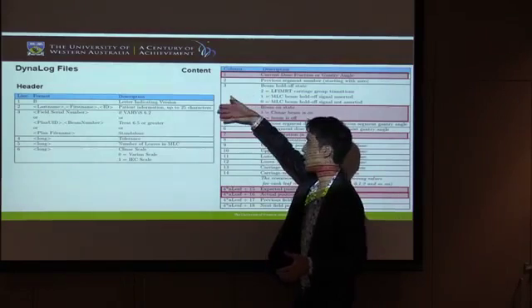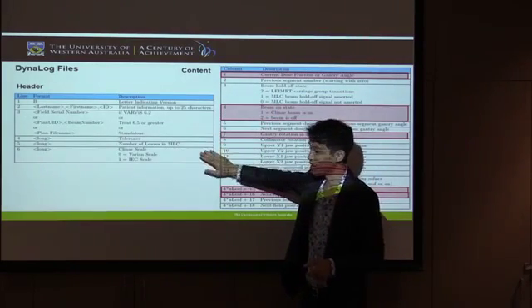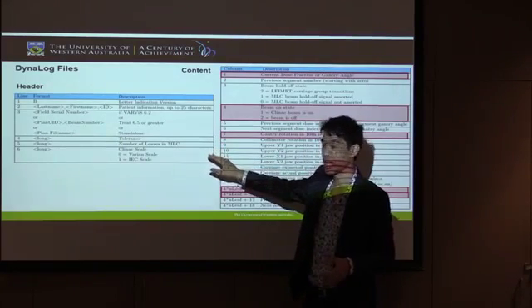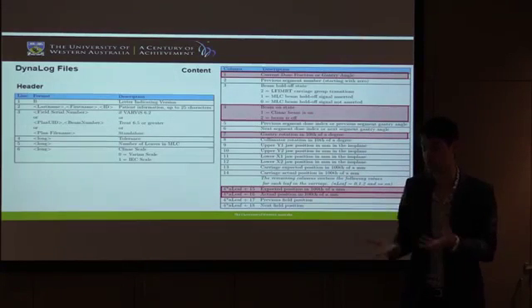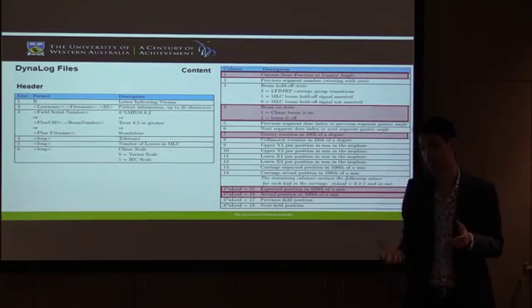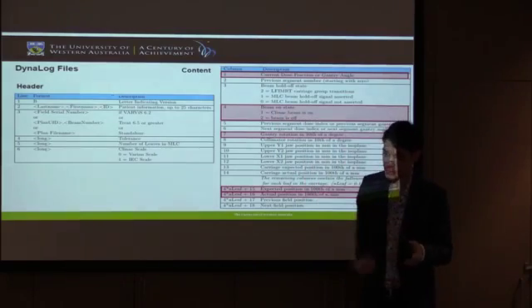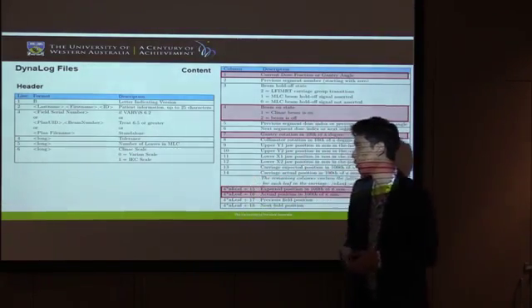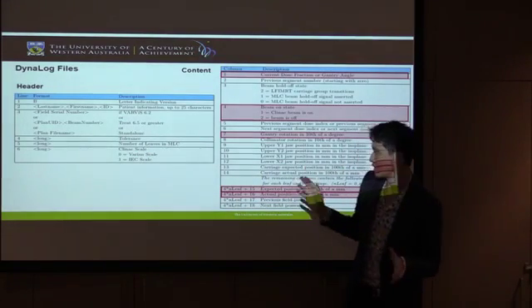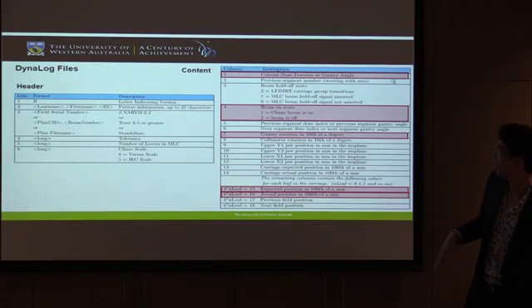So on the header, you've got your patient ID, the number of leaves in the MLC, whether it's being delivered in Varian scale or IEC scale. What Varian's done is they've made their own scale. In IEC scale, gantry angle 0 is directly above the patient, 180 is directly below. In Varian scale, 180 is directly above, and 0 degrees is directly below. And the default is to deliver in Varian scale for reasons. That's just annoying, but I can easily change it back to IEC scale.